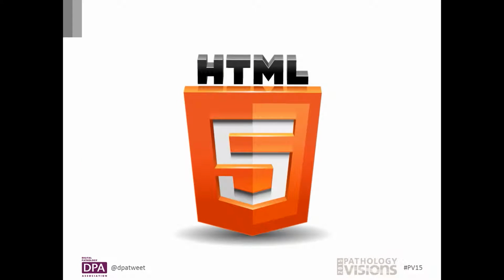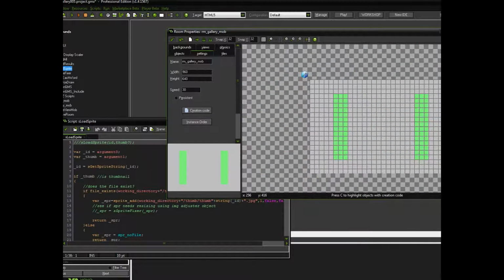We also selected HTML5 as our export platform. This means that the Atlas can be hosted as a web app on any website. We would not need to go through and pay the developer fees for the Apple or Android app stores. This also dramatically increased the accessibility in terms of allowing the end user to modify our Atlas content and host it from their own website. More on this shortly. Here's what the design interface looks like.